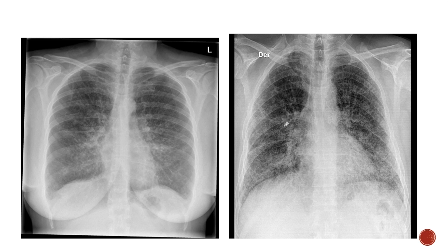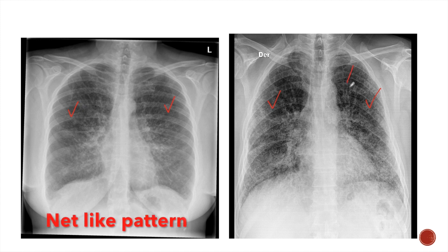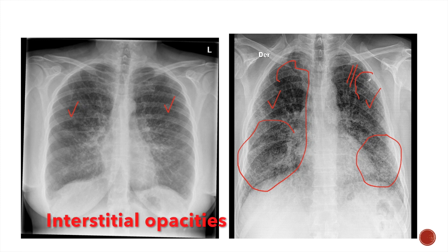Now look at these two X-rays. In both these X-rays we can see that the opacities are bilateral, more or less symmetrical, do not coalesce with each other, and have a net-like pattern. We can see the net-like pattern of opacity throughout both lungs. These are interstitial opacities, and both these cases are interstitial lung disease.